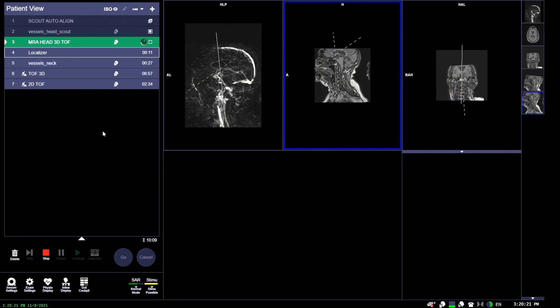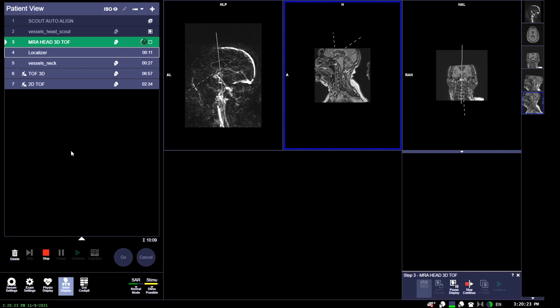As we continue on, this MRA is an actual MRA head and MRA neck together, so we're also positioning for the neck, which we will cover in a separate section.